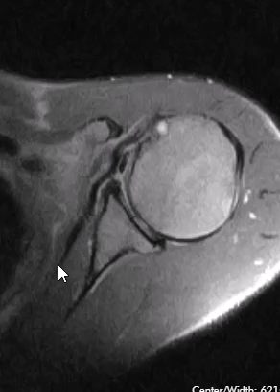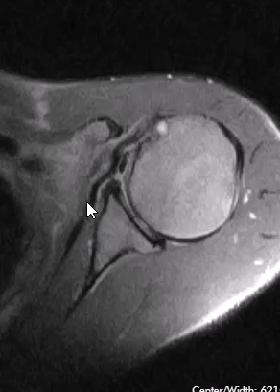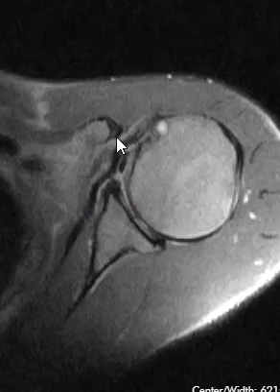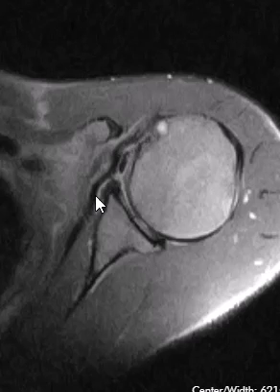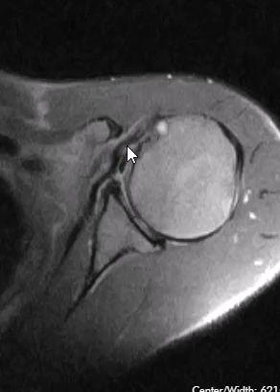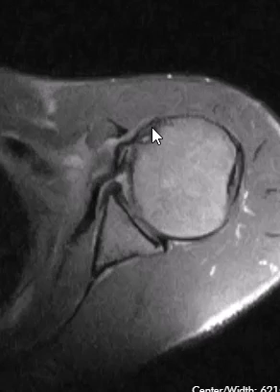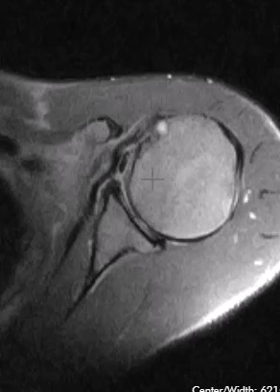They have a problem with the subscapularis tendon. Instead of being really straight and taut, see it's wavy — so it has loss of the normal tensile strength here, and so it is torn from the distal attachment.